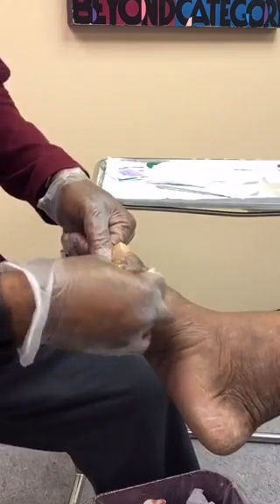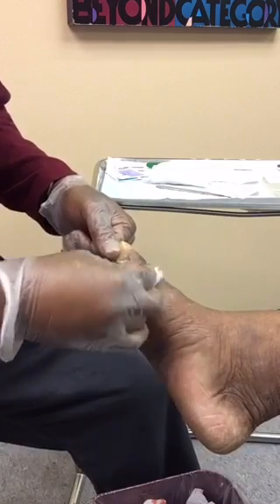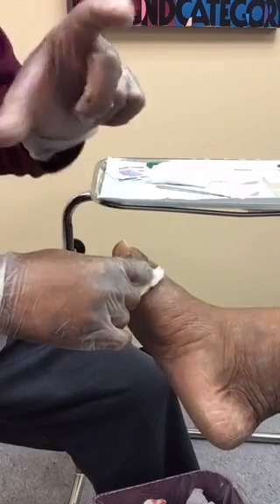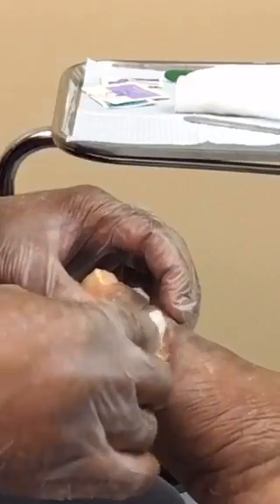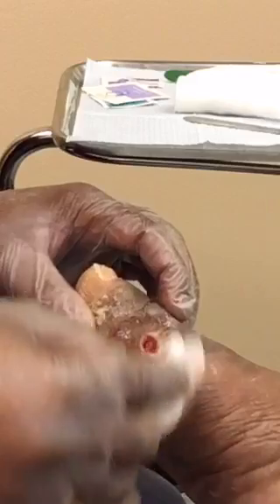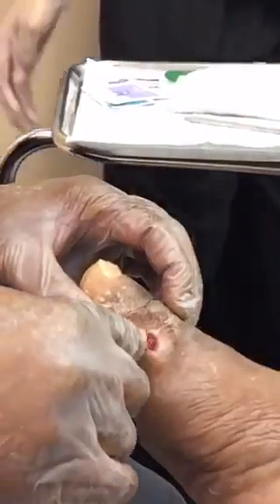A little warm cleanser to get everything ready. Now what I'm going to do is apply a little direct pressure to stop the bleeding. We debrided the callus rim of the wound, got rid of the fibrotic scar-like tissue over top of the wound, and we now have a nice bleeding granulation bed here, ready for the graft.